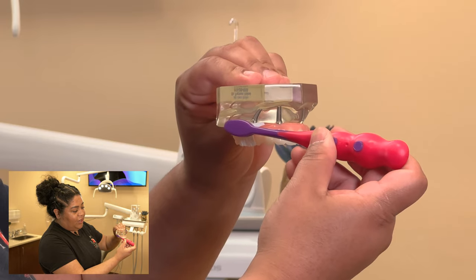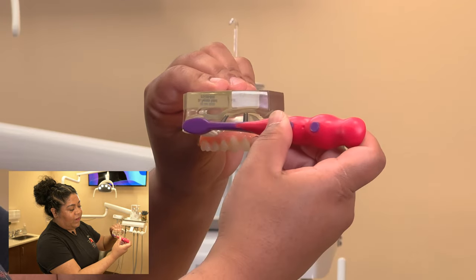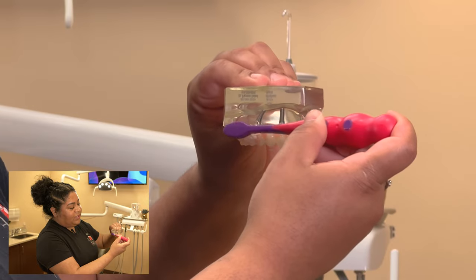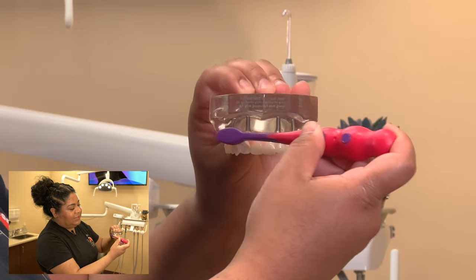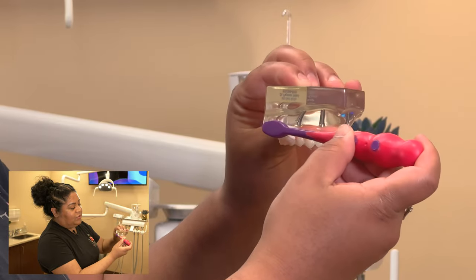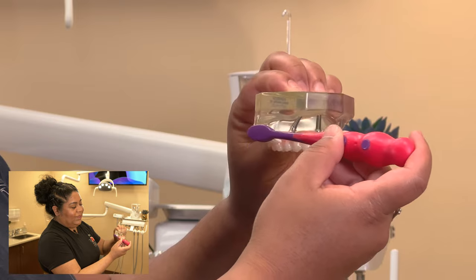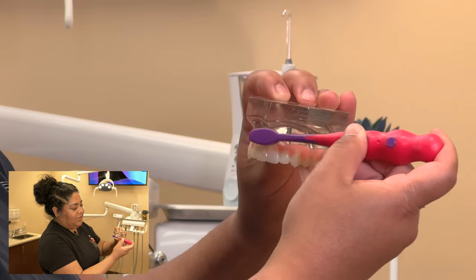Once you're seated at that junction, do not go side to side and do not go up and down — go in circles. Small circles as you move your way to the other side, making sure at all times you keep those bristles underneath the bridge. I do not want you to lift out, reposition, and lift out again. Instead, glide, keeping those bristles underneath the bridge as much as you can.